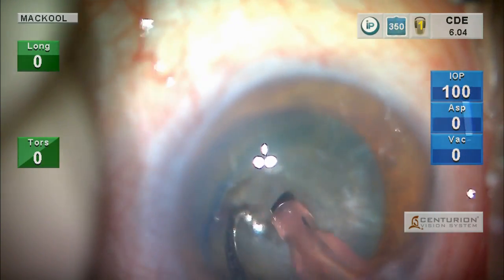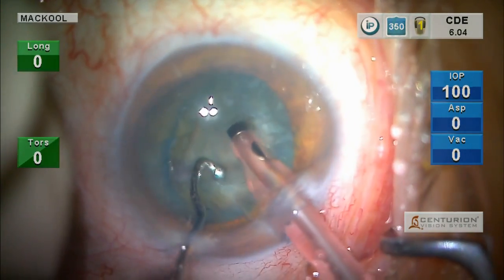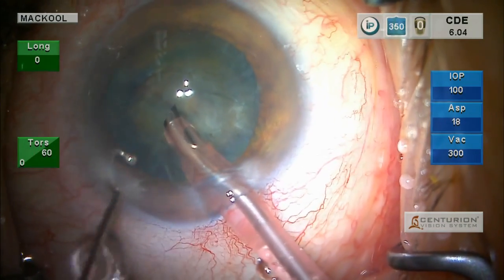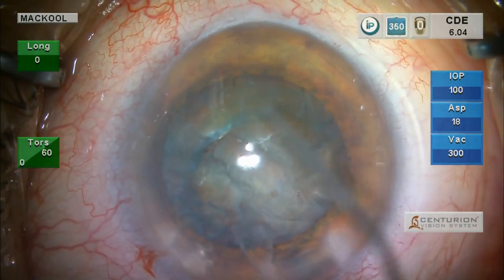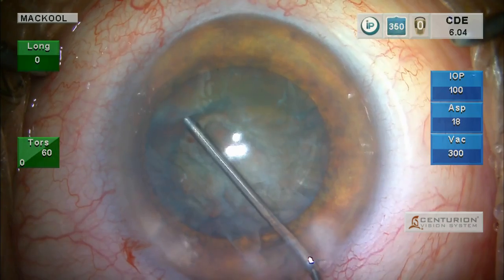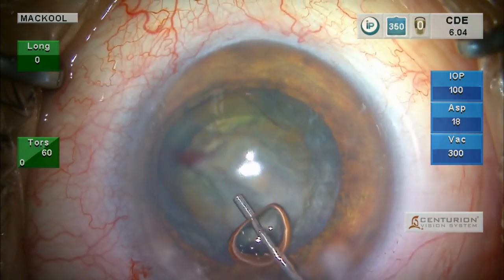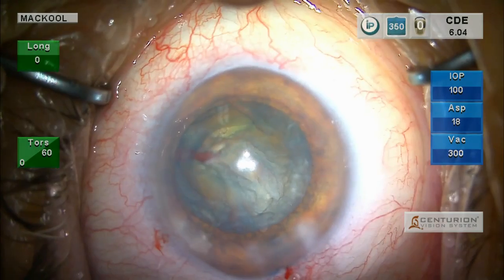I'm sculpting more in the center here because that's going to make it easier to separate the remaining nuclear segments — you can see that they just separated there. I still have the hemi-nucleus, but I'm not happy with the apparent depression of the capsule over on this area, so I'm going to put in capsule retractors. The anterior capsule comes forward, but when I increase pressure in the anterior chamber it wants to go backward, so I'm going to fill the capsular sac. We can see the rhexis because it's stained — otherwise I might be having trouble because there's no red reflex there.